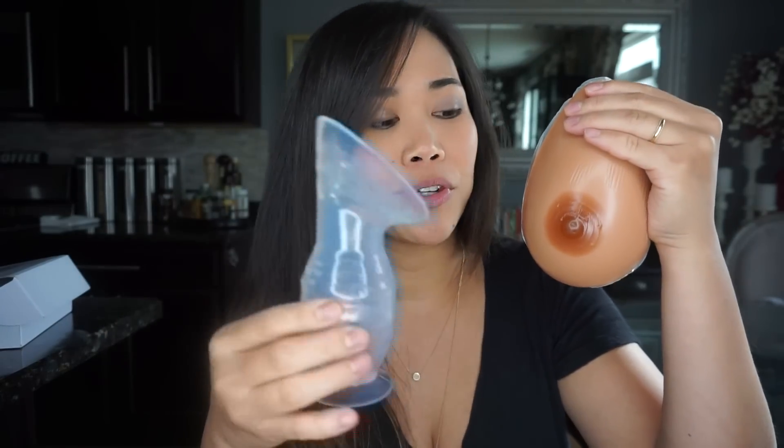So to begin, I have this silicone fake boobie because I really want to demonstrate how to use a Haakaa pump. This is my Haakaa pump. So before, I would just squeeze and it will suction my boob just like that.